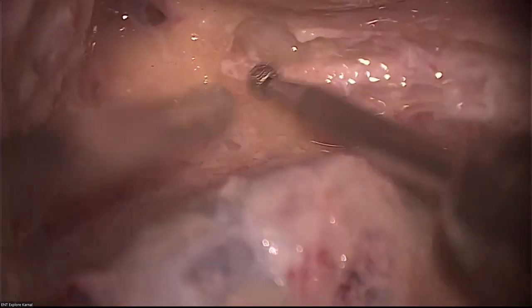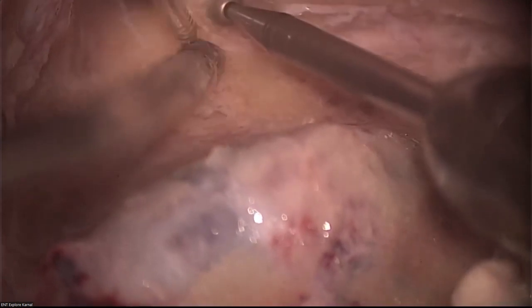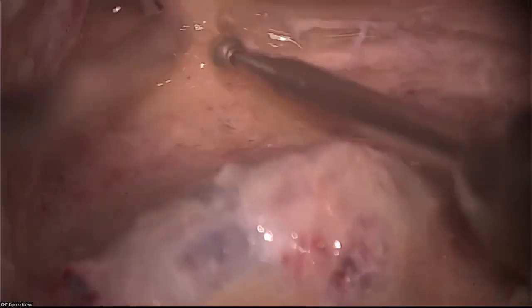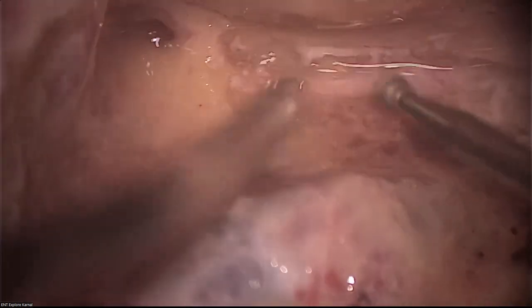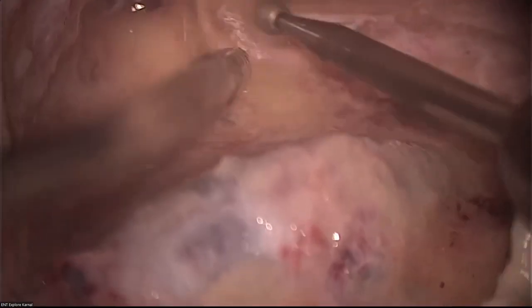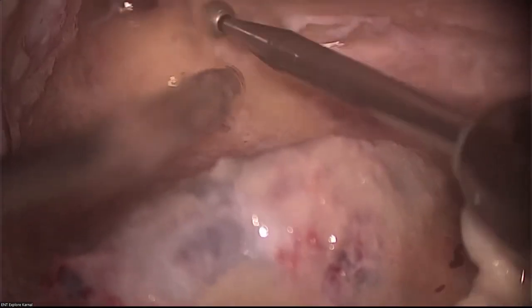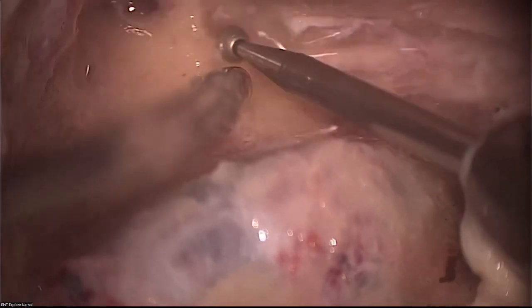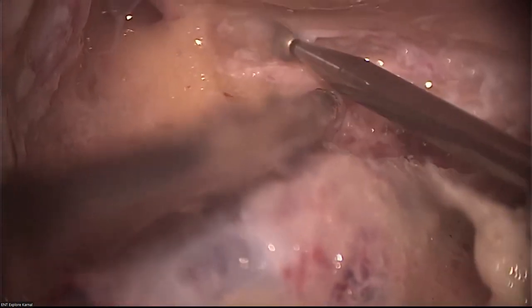Now, in order to get more space where the nerves are diverging, I need to go a little superior. I can go up to some millimetric distance from the fossa incudis. See this? Hardly any cell there in the facial recess. It is not pneumatized that way.